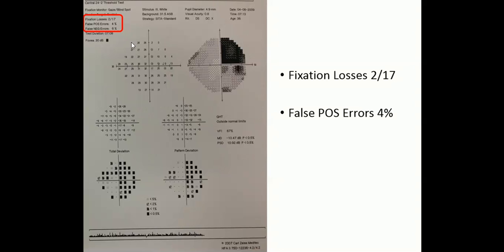So their strategy is they're just going to come in and they're just going to keep pressing the clicker, because when you press the clicker, you're not being tested on where you saw the stimulus. It's just, did you see it or did you not? No one comes and says, where did you see it? Was it really up to the right or straight ahead? So a patient might think that they can just press the clicker continuously and just keep pressing yes, yes, yes, I see it, yes, I see it, and get away with it.